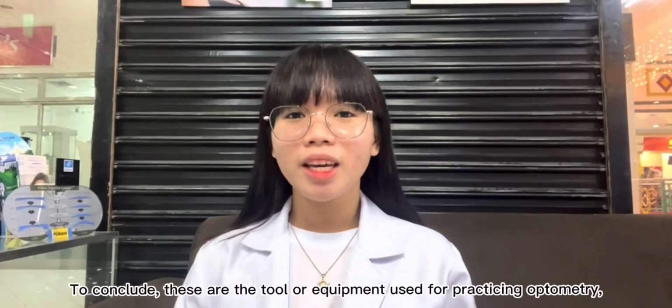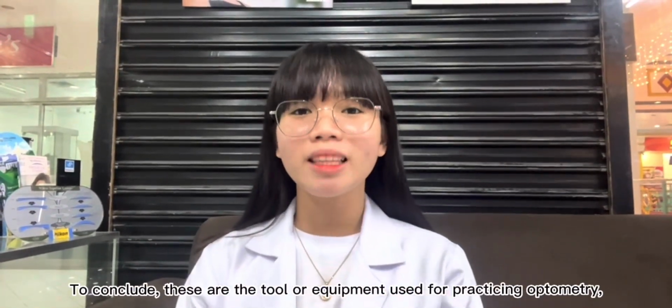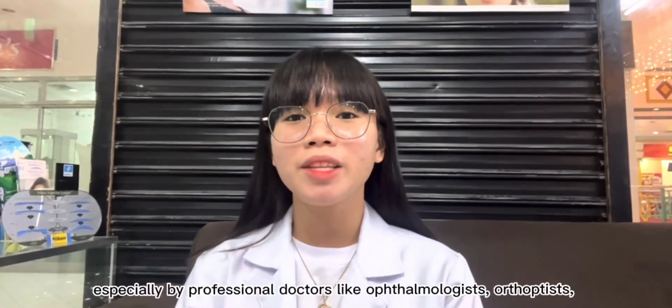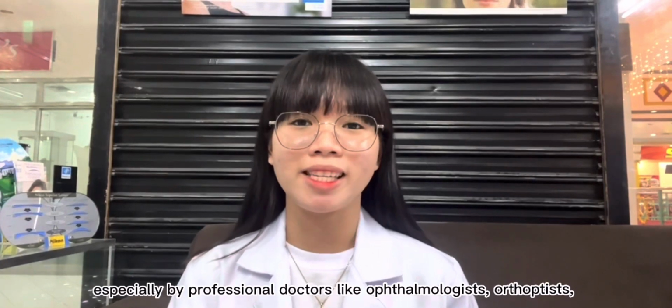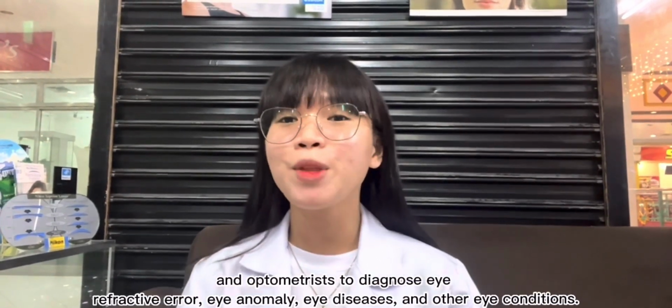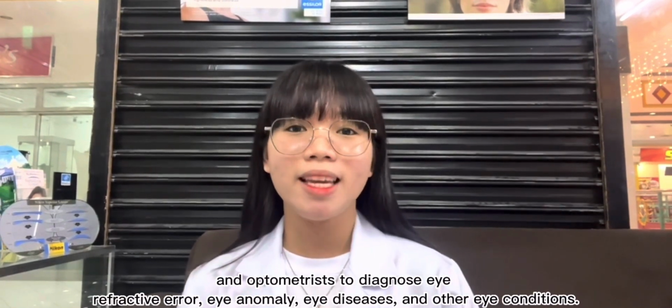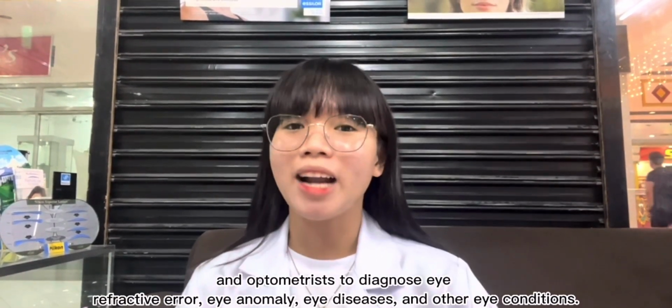To conclude, these are the tools or equipment used for practicing optometry, especially by the professional doctors like ophthalmologists, orthoptists, and optometrists to diagnose eye refractive error, eye anomaly, eye diseases, and other eye conditions.